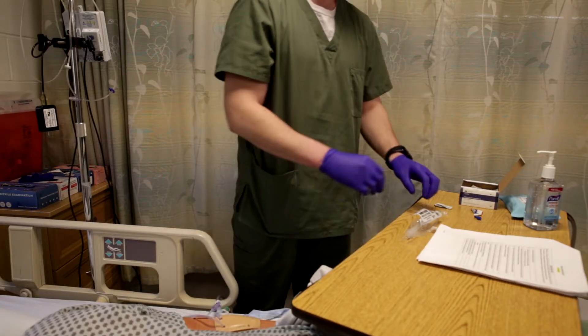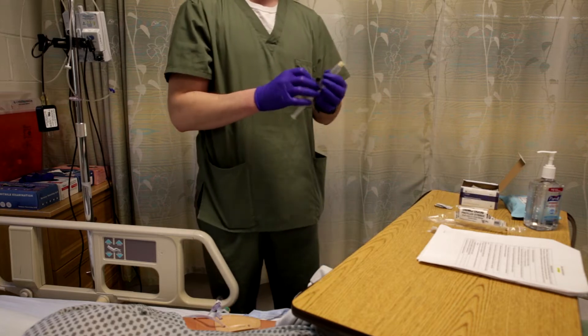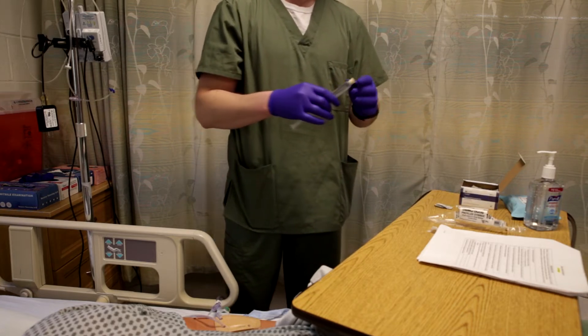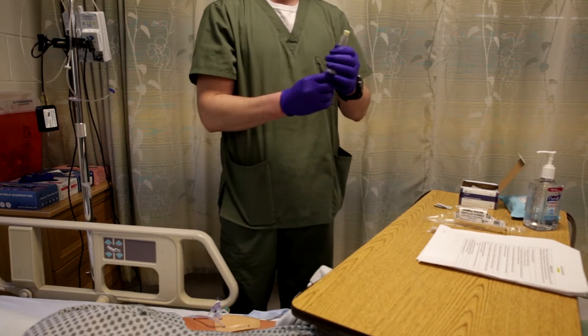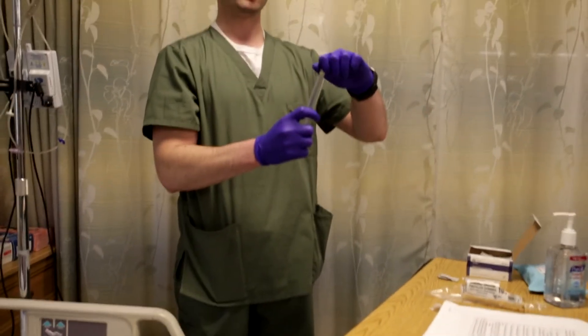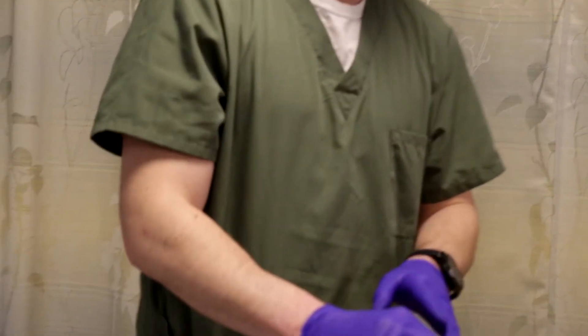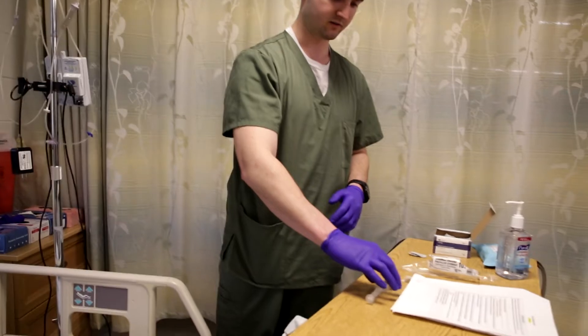Now that I have inspected the IV site, I'm going to open up my flush. I have my normal saline 10 ml syringe. I'm going to pull back on this to get the air bubble, and I'm going to loosen this a little bit to get the fluid out. Reconnect this to keep it sterile. Now my IV flush is ready to go — all air is out.